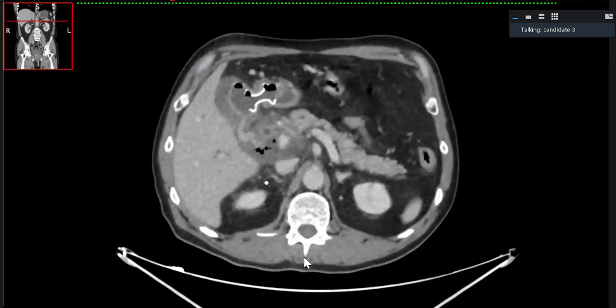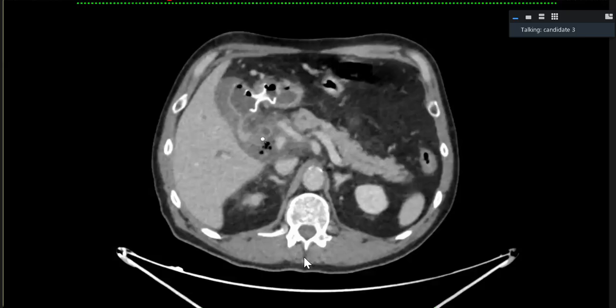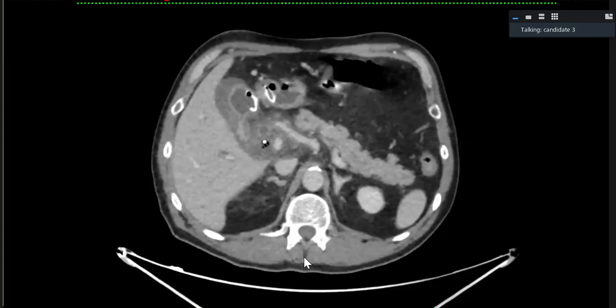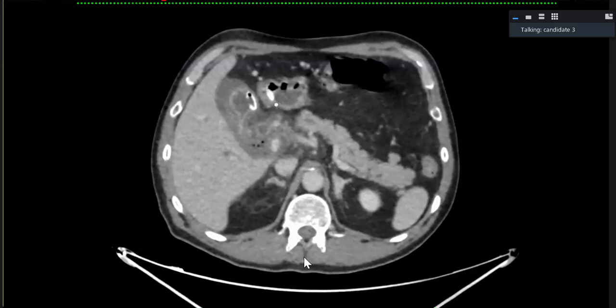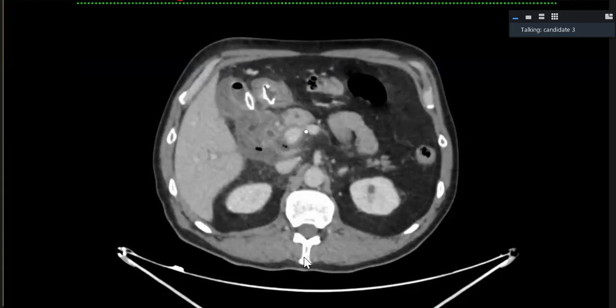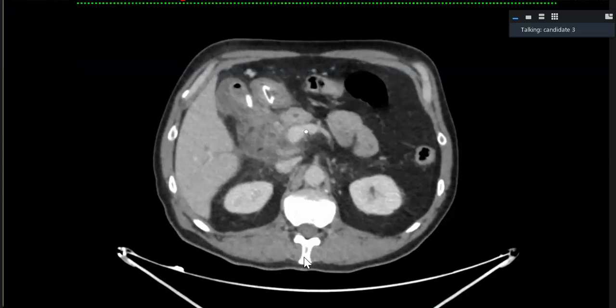I'm just making an assumption that there was some obstruction between the gallbladder and CBD, like in Mirizzi syndrome, or anything obstructing the CBD from outside, and they can't approach this area. In that case, they might have tried to drain the gallbladder by an internal drainage procedure.